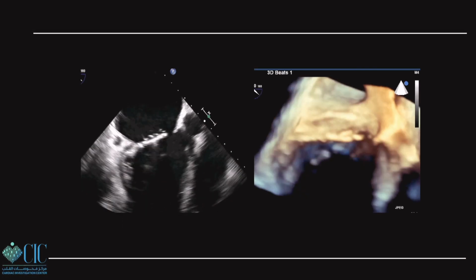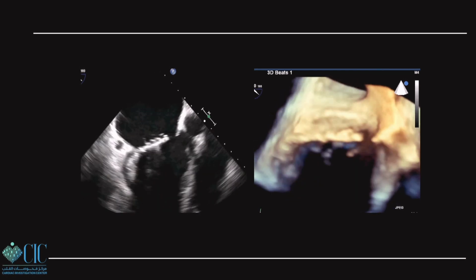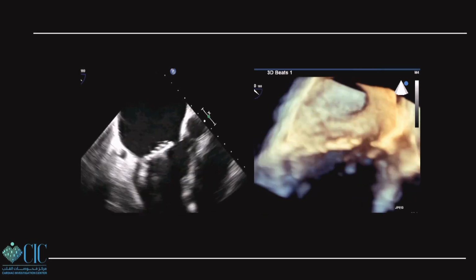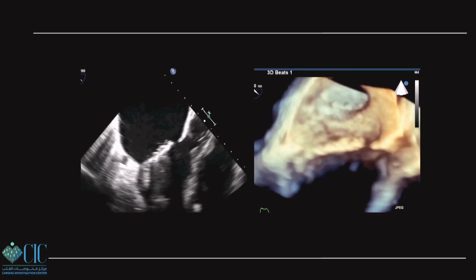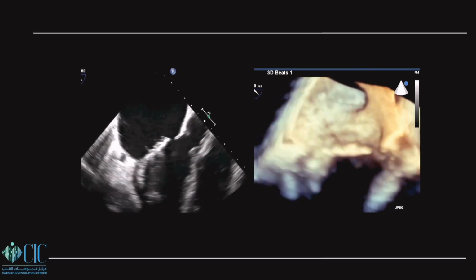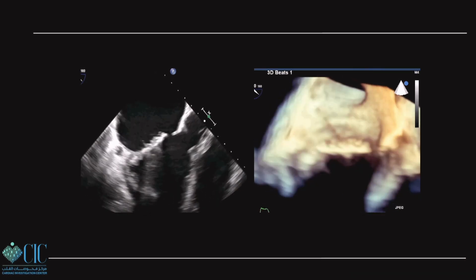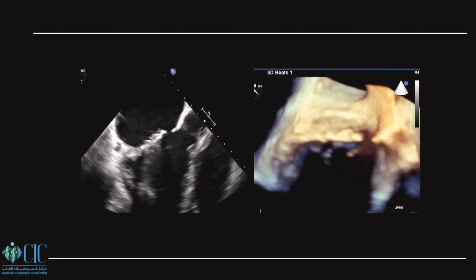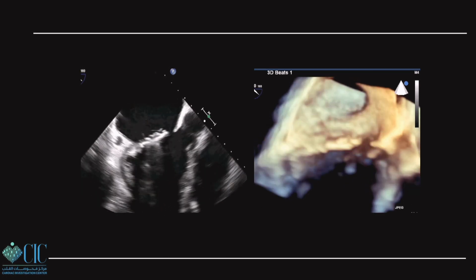Okay, well and good. Now we will activate the narrow sector live 3D. Who has attended yesterday's workshop? Yeah, we have seen the narrow sector live 3D, not the 3D zoom, not the full volume. Why is that? Because narrow sector live 3D gives you the same frame you started with some elevation. So if you see a defect in the 2D, and then you see a defect in the 3D, this is a real defect, not an artifact. So don't let the defect go away from your sight. Keep the defect in the screen, just narrow sector live 3D, then you will see the defect with some elevation, the thickness, the depth of the image. Now I know this is a defect.